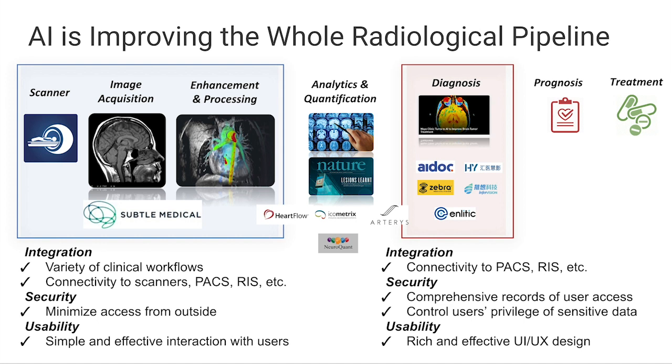You see less products being released right now, but these researchers and products are focusing on generating high quality images and visualization of these images for later stage to use them. So I want to emphasize that these two types of applications have very different characteristics and concerns when you try to implement them in the clinical settings.